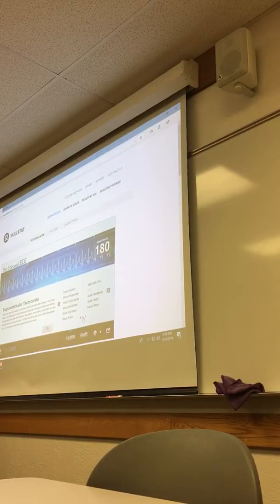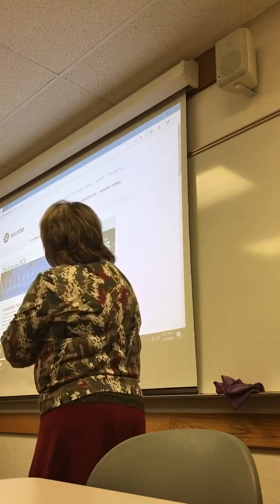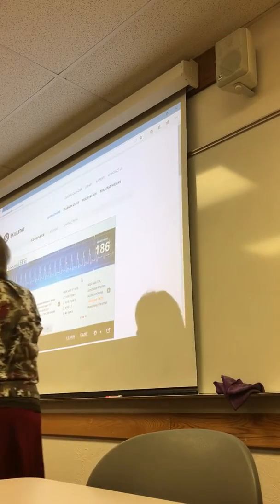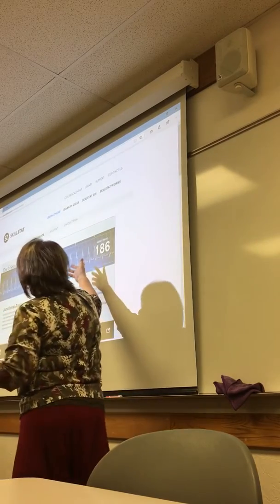Let's look now and compare that to junctional tachycardia. So again, we've got that super high heart rate. We have no P wave and a wider QRS. I don't like that this is a wider QRS, because it's above the branch, it should be a normal QRS. I think it even tells you that in there. The QRSs are usually narrow.